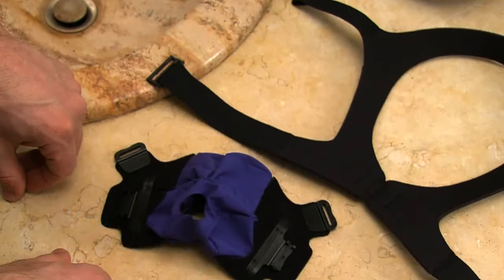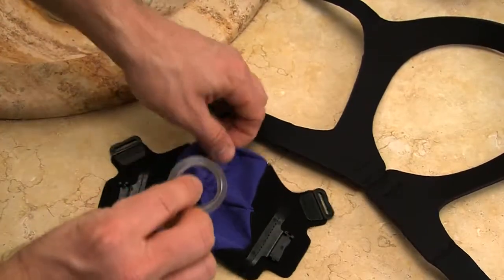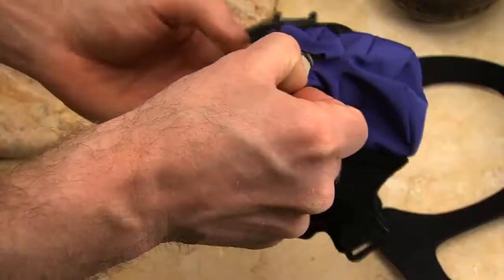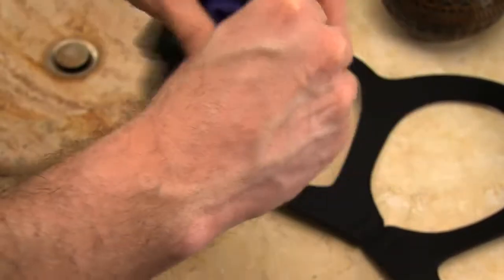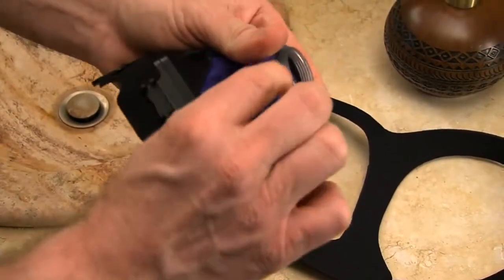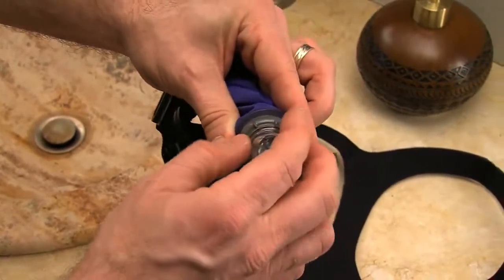Now we will demonstrate how to attach your 90-degree elbow AAV swivel to the mask. The same process is used for all sizes. First, direct the threaded piece through the inside of the oral interface and out the hole in the front of the mask. Second, place the washer over the threads to ensure that the fabric does not ride up onto the threads. Third, screw the nut onto the threaded piece to secure the swivel.